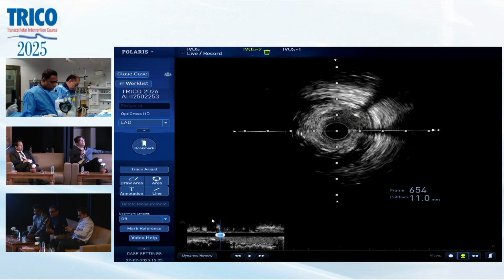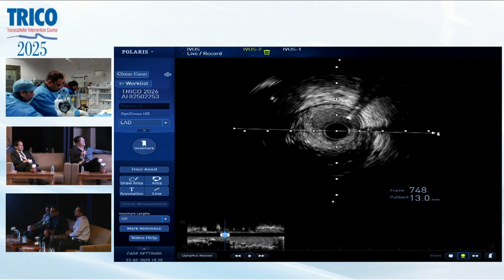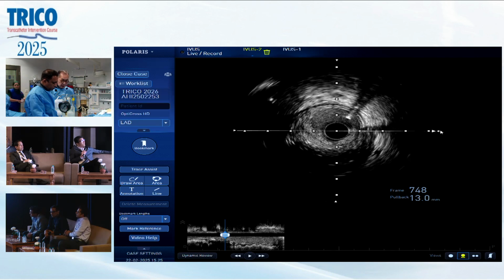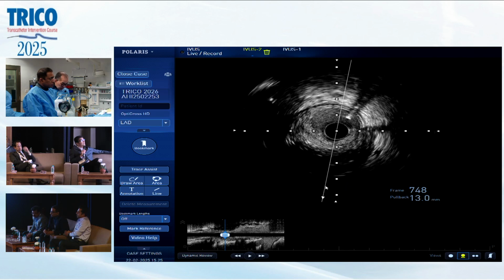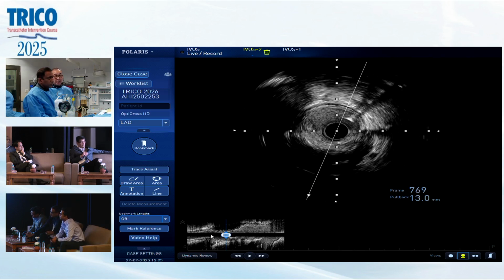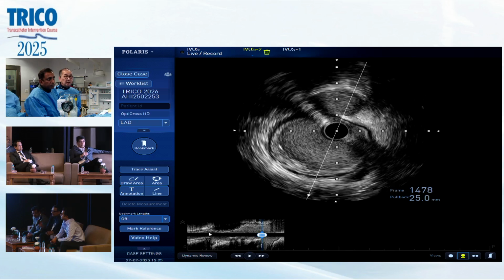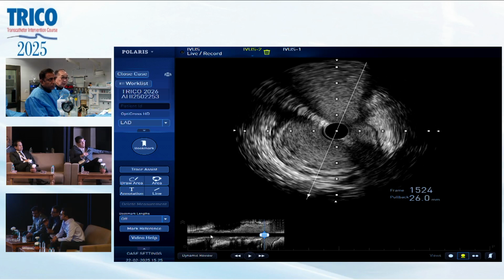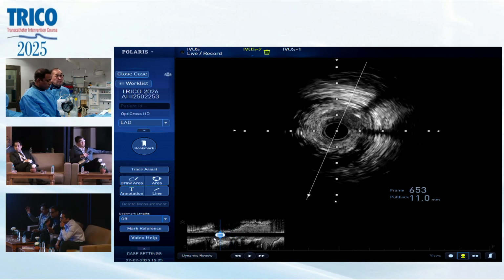Are you treating the diagonal ostia at all before placing the LAD stent, and why? I don't think so. Once the IVUS showed that it's already dilated, the ostium is not that bad, so I think we can change our strategy. I think the diagonal has already been ballooned once, so it should not be a problem.